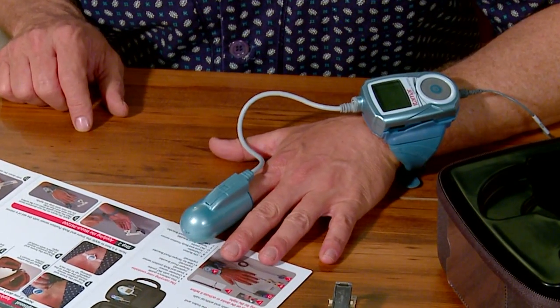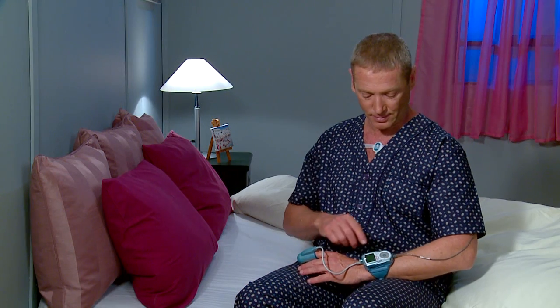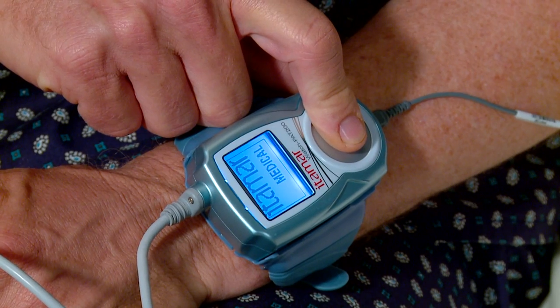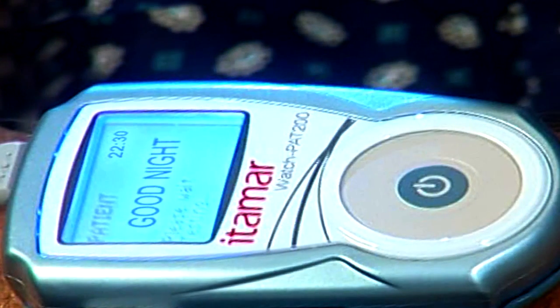You are now ready to turn the WatchPat on. Get into bed and press firmly on the round button for a few seconds. Keep pressing until 'Itamar Medical' is displayed on the LCD screen. After about 30 seconds, 'Good Night' in the middle of the screen indicates that the study has started.